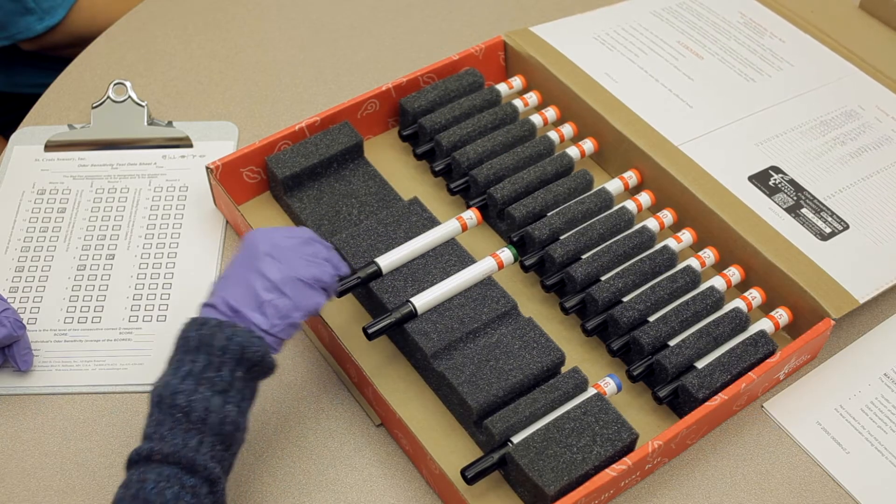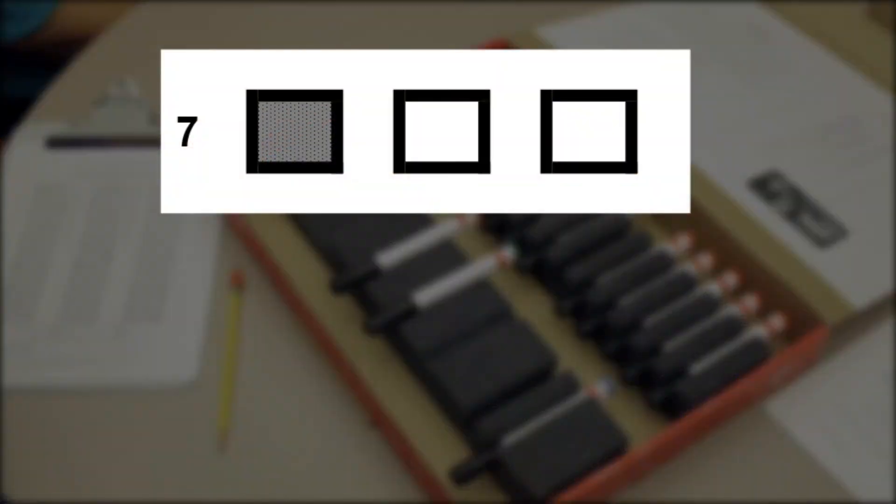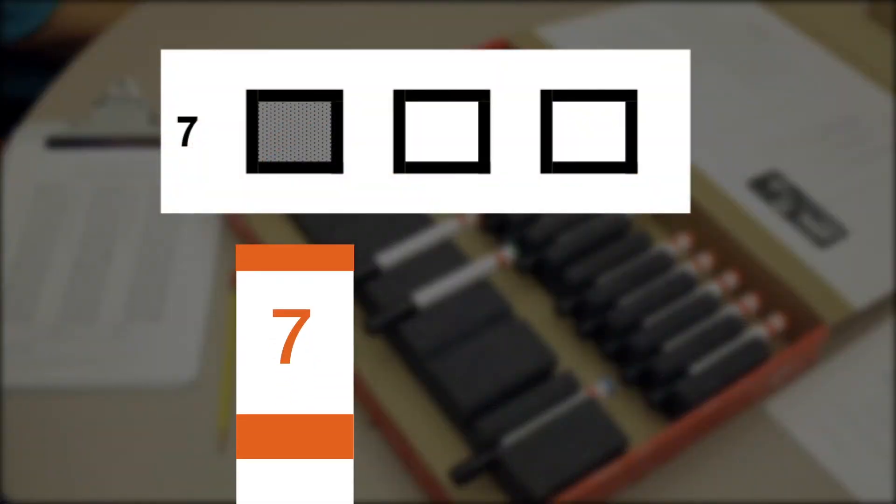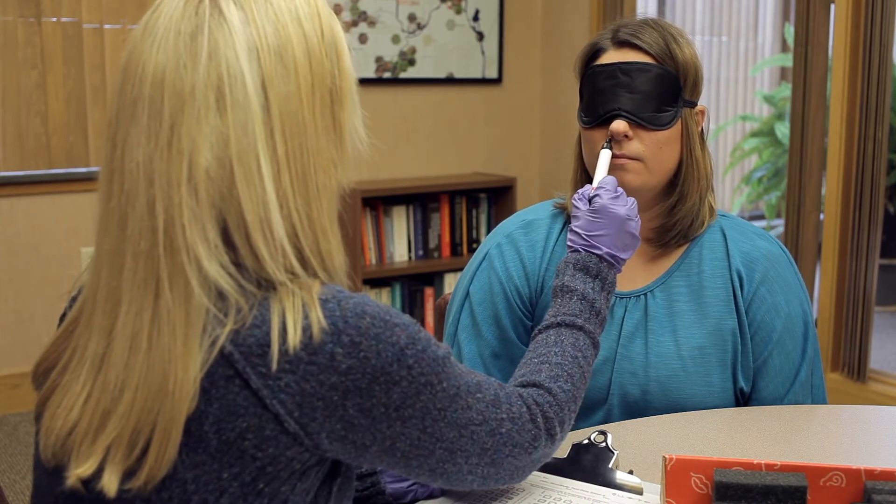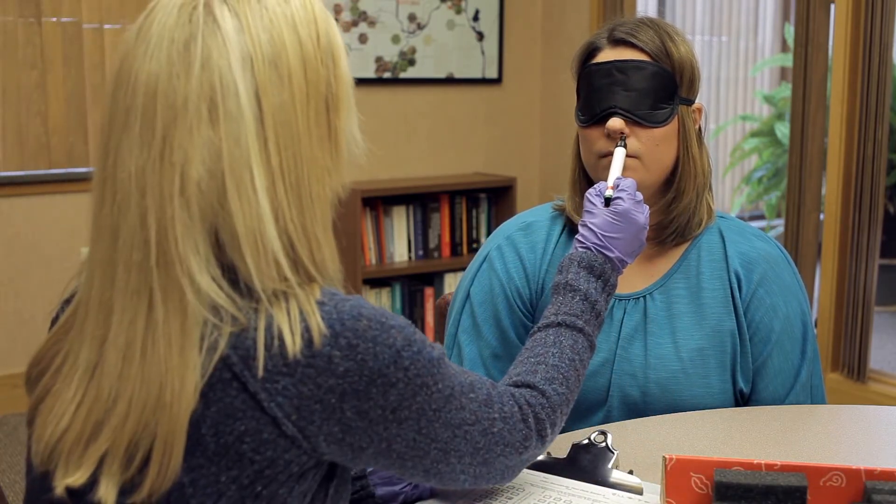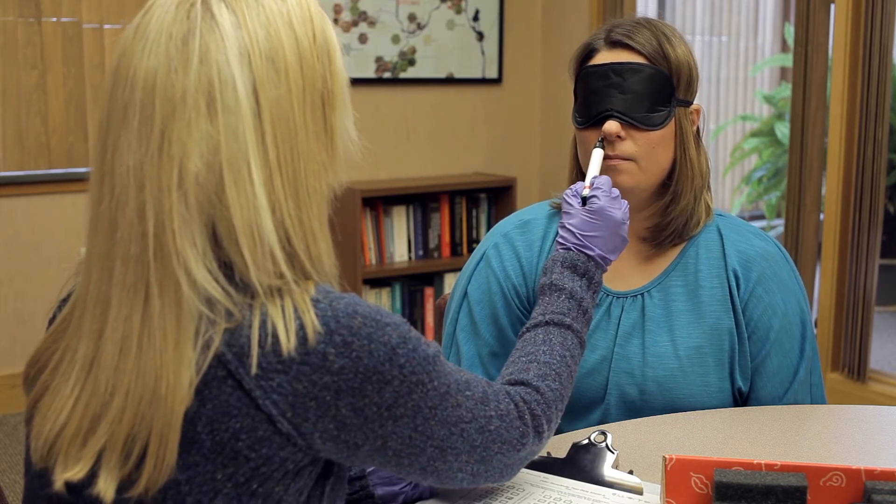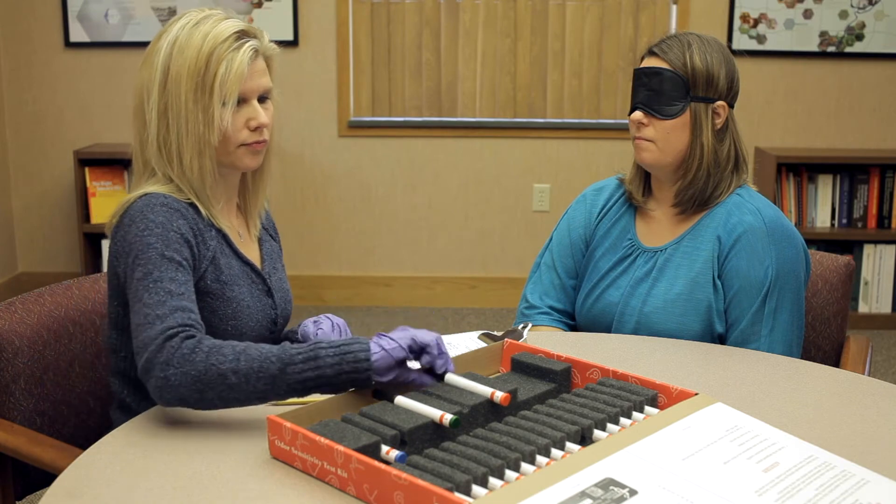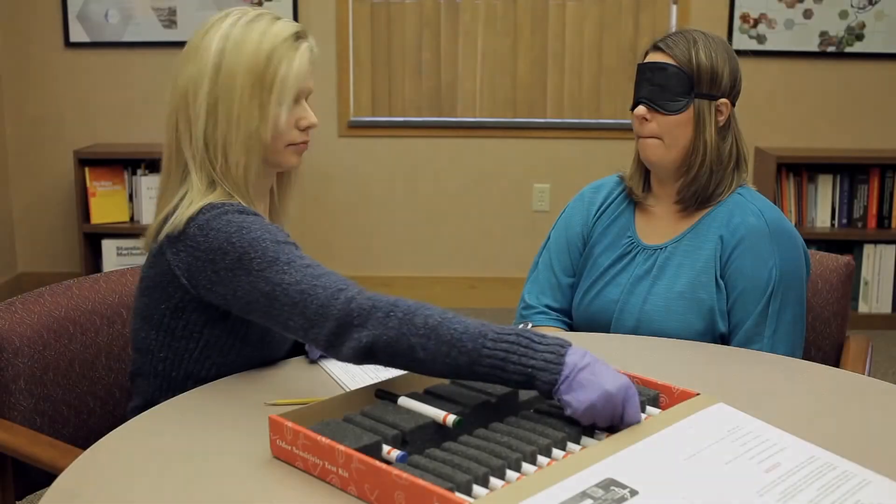When the test administrator presents the number seven pen sequence, the number seven pen is placed in the left position, as seen by the shaded square on the datasheet. One, sniff. Sniff. Sniff. Two, sniff. Sniff. Sniff. Three, sniff. Sniff. Which pen? I detect number one. The test administrator records the response and then sets up the next pen sequence and continues presenting the pens.